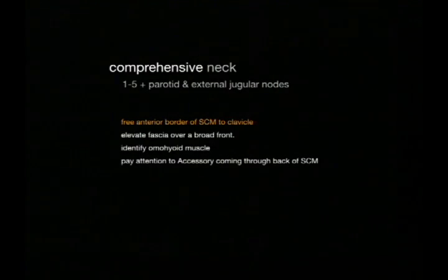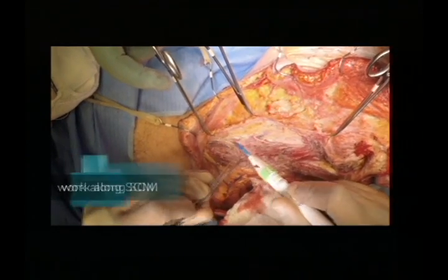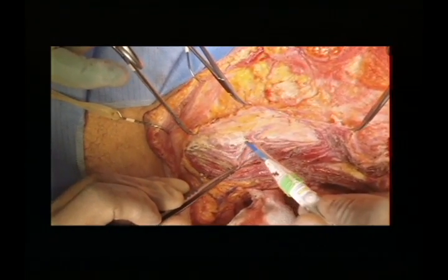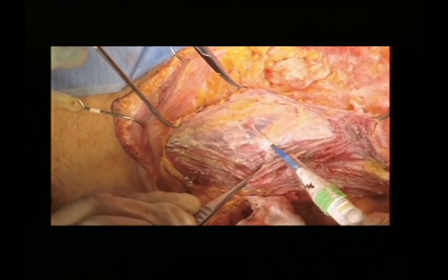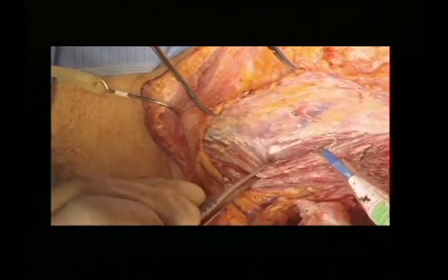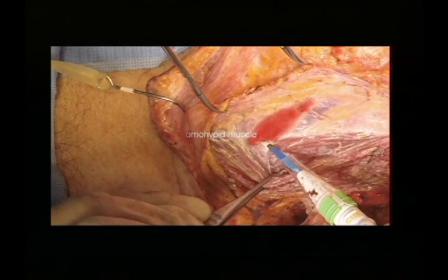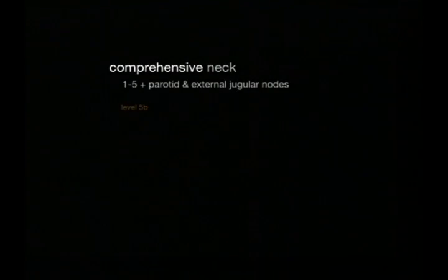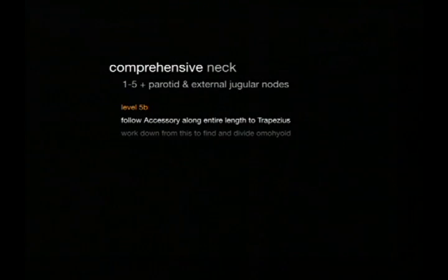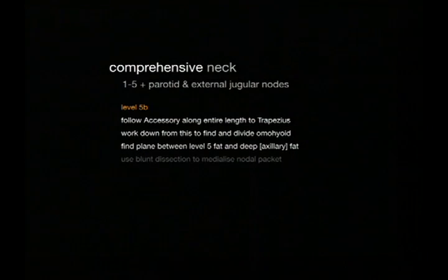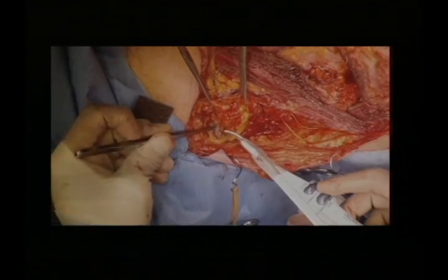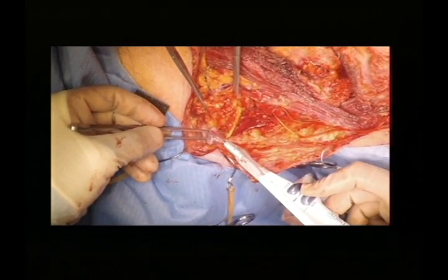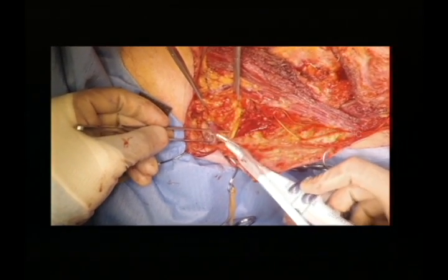Once the spinal accessory nerve has been isolated at the top end, we head to the bottom end and free the fascia off the front of the sternocleidomastoid muscle using monopolar diathermy, working on a broad front. Be careful here because you can rotate the sternocleidomastoid out too much and injure the spinal accessory nerve lower down. We're looking for the omohyoid muscle — we take that down towards the clavicle and follow it where it comes through the sternocleidomastoid at the back. We've started using the harmonic scalpel to divide the omohyoid and also to manage troublesome lymphatics and vessels in this area.